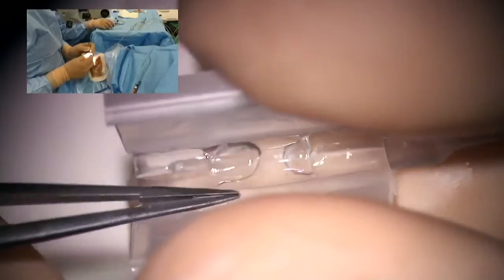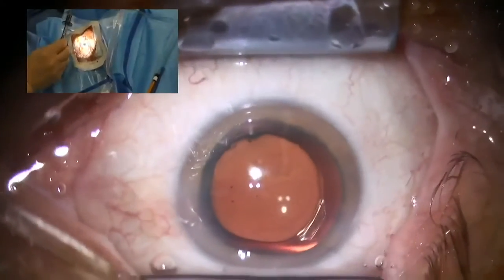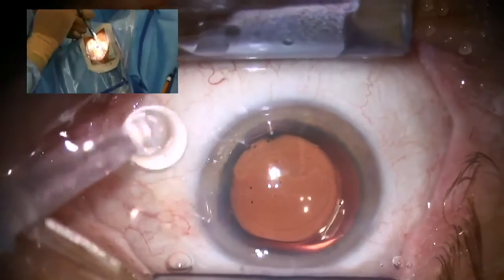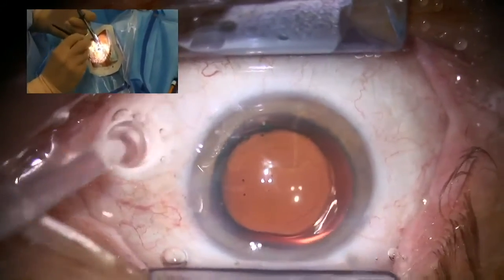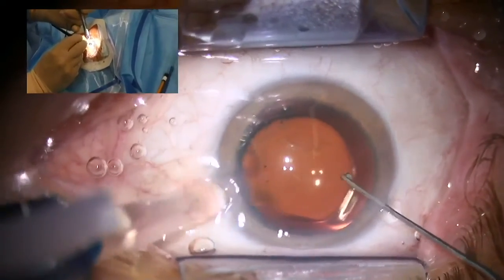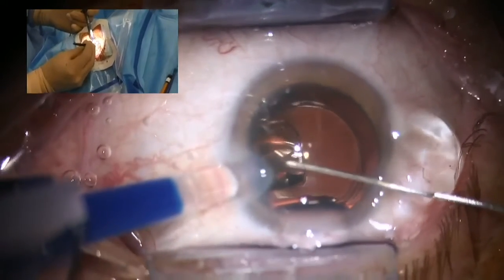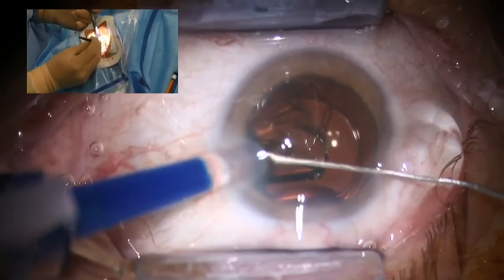So again, inverse U shape. Press the optic downwards. Check for incarceration. So again. You see my cartridge is inside the 2 mm incision, not inside the eye, but inside the clear corneal incision.